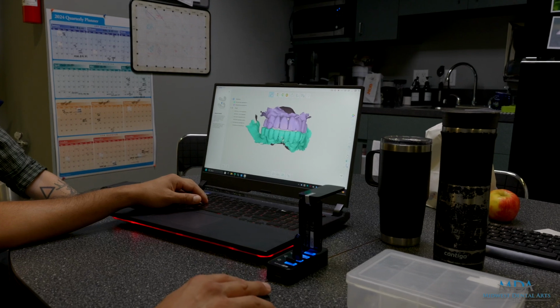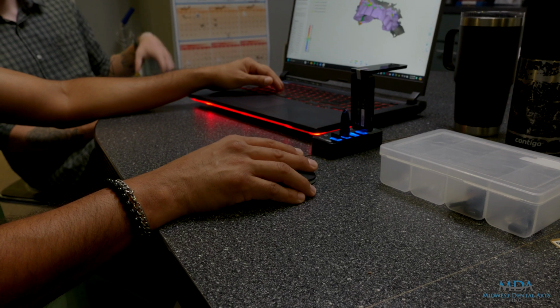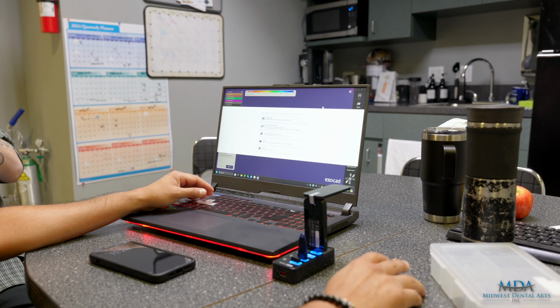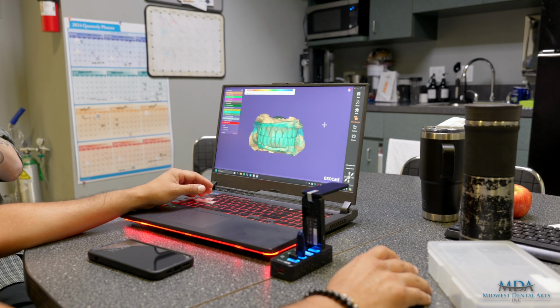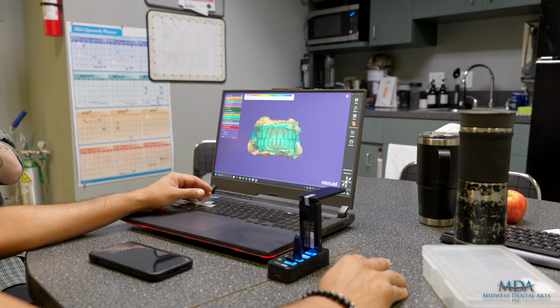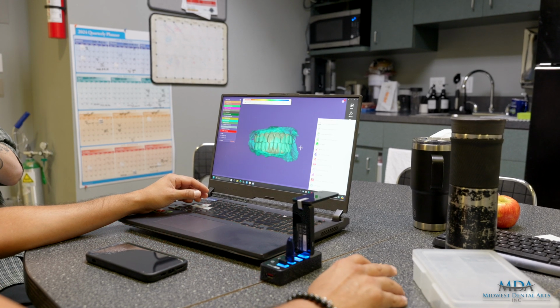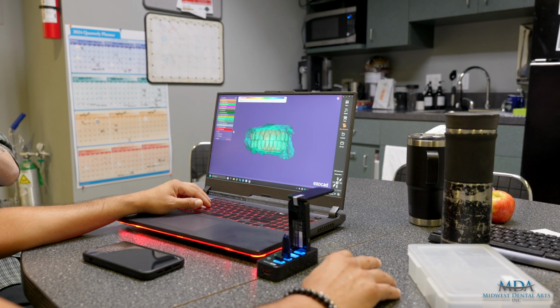This is what he shows up with. This is what he had in his mouth. It's a couple things. We have initial scans and wax ups. So what we need to pull off of these designs over here, let's go back. It's a couple of things. We need to pull off this wax up that's right here. So all of this stuff we're gonna transfer to the other side.